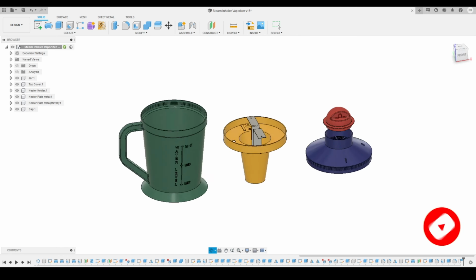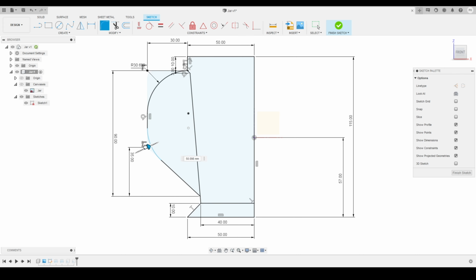So now we'll move on to defining this line. I will make sure that this line is a vertical line. So I will just select the line, and apply the vertical constraint. So here you can see now I will activate my fillet tool and will make sure that the corners of our handle are both filleted here and here. So I will just specify the fillet radius over here. I'm just going to use 15 millimeter of fillet radius over here. So I will just write 15 and press enter. So here you can see this is the shape of the handle we got.